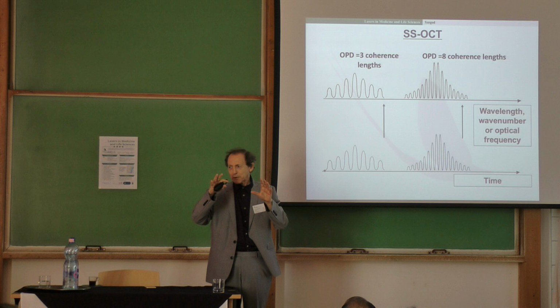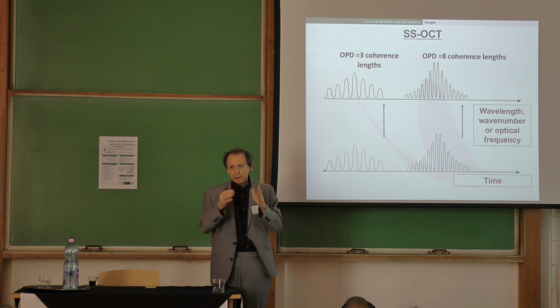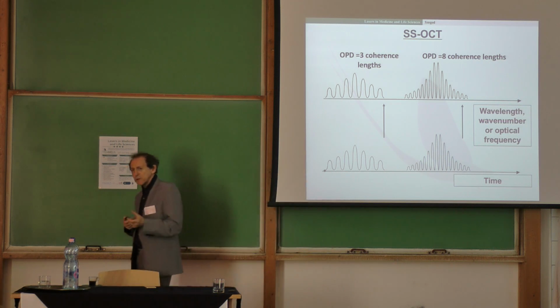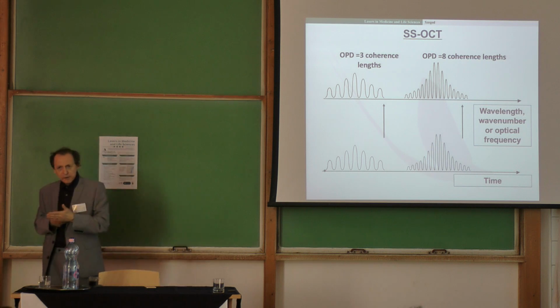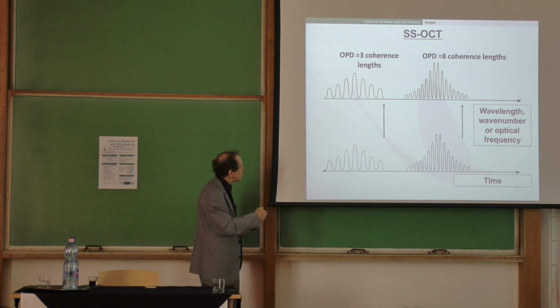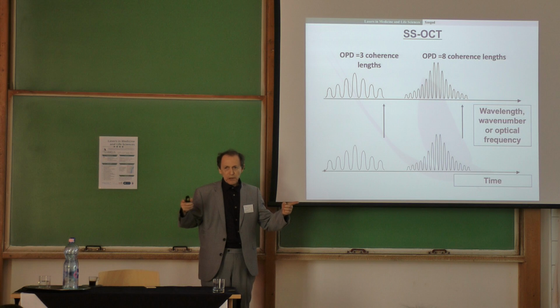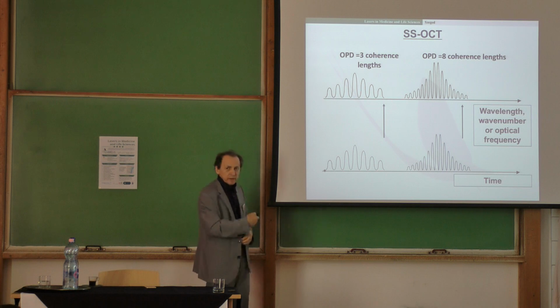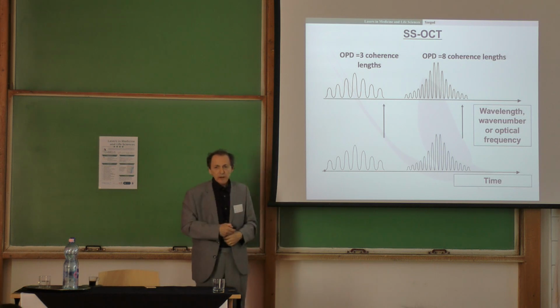Do you have that idea about an optical spectrum? What is that, an optical spectrum? You heard about the rainbow. What is the rainbow? So every modern OCT will have a prism or a diffraction grating spreading the wavelengths over a line camera. The camera has a number of pixels, 1,000 pixels. So this is color, like wavelengths. And this is the spectrum from the interferometer.